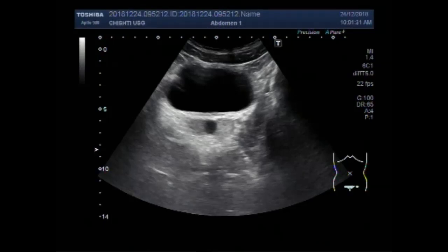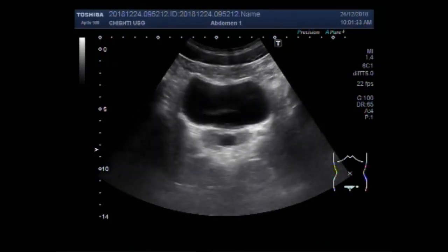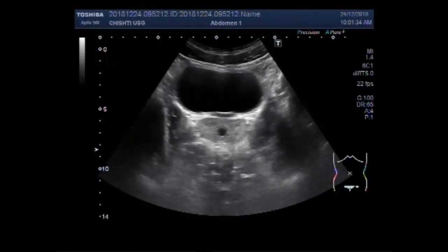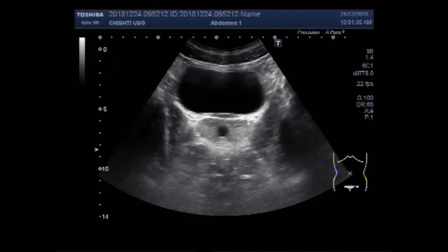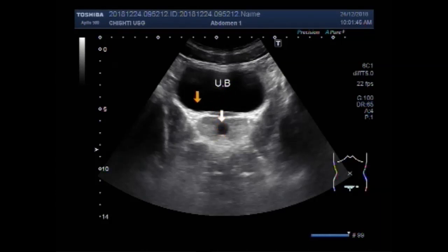Dear viewers, I hope you are all fine. This ultrasound video shows a Prostatic Utricle Cyst. You can see the Prostatic Utricle Cyst.